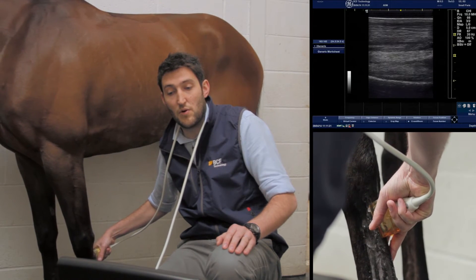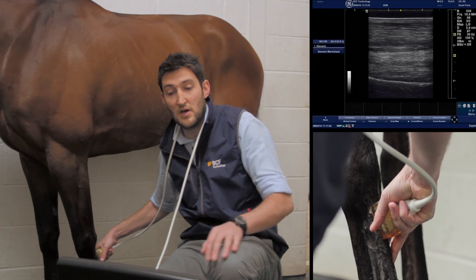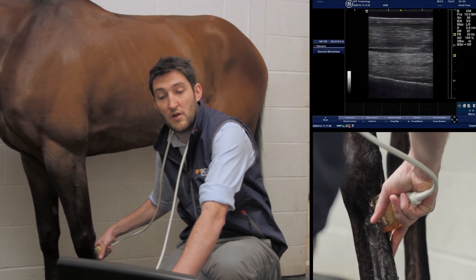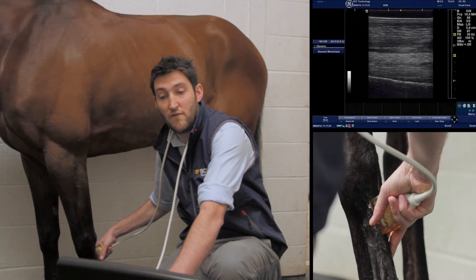Once we've got our image we optimise it as best we can. In fact we can come slightly proximally there, and freeze.